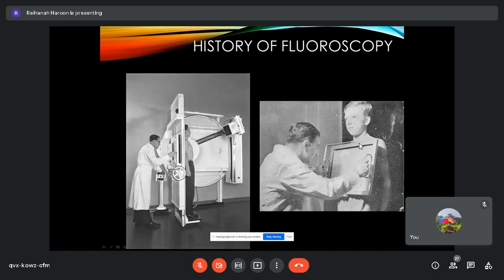The fourth difference, apart from the machine, is in the exposure. When you give X-ray to a patient, you press one button, like what you have seen in the ward when they do portable X-ray. Somebody will shout, X-ray, and somebody will press the button, and there'll be one camera click. And that's it. That is what we call one exposure, and that is a relatively high dose to get a very good image. And that's what happens in the department.